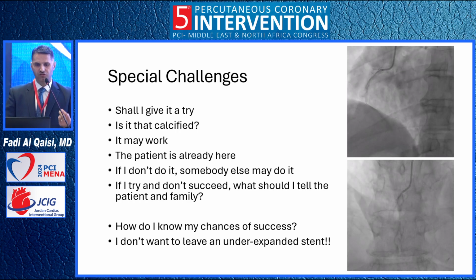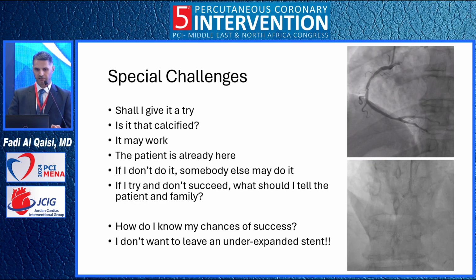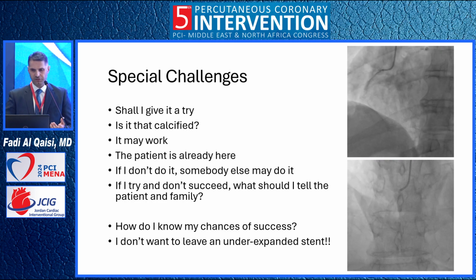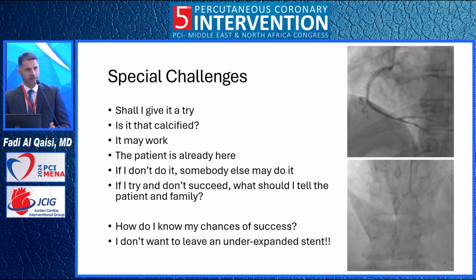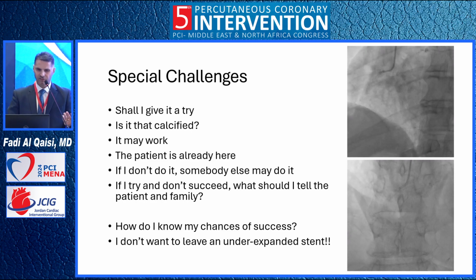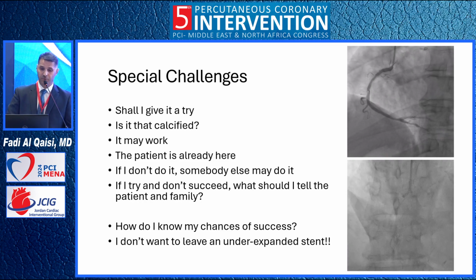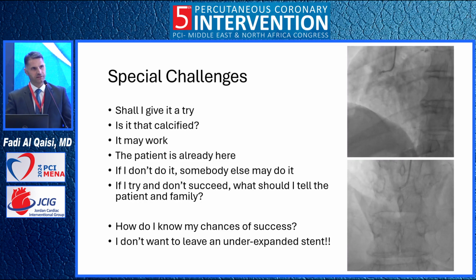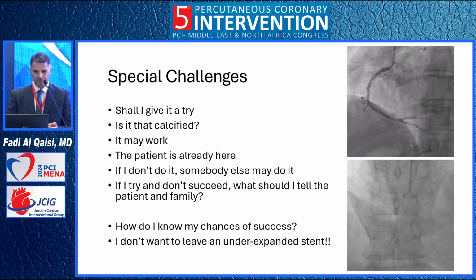And we have special challenges in Jordan. In Amman, we have our own challenges. When we see lesions like these, this is a typical case I encountered the other day. Shall I give it a try? Is it really that calcified? It may work. The patient is already here. He paid the admission, paid the package, and he is on my table.